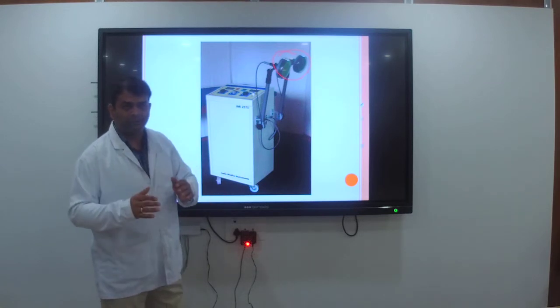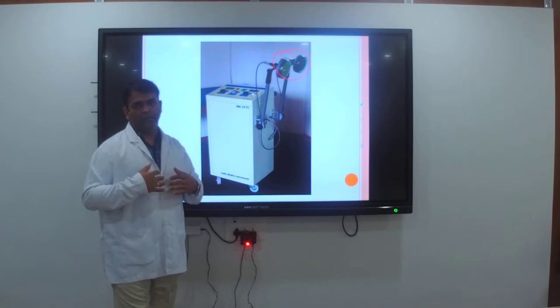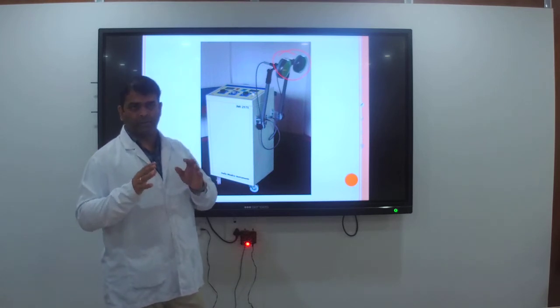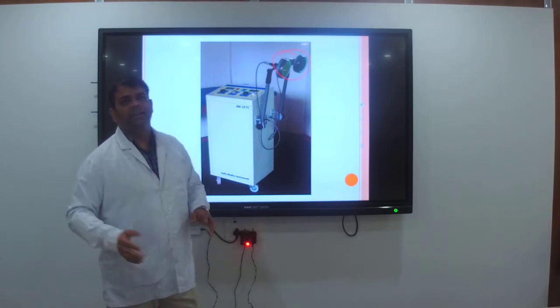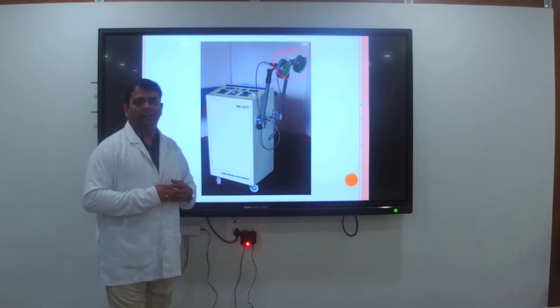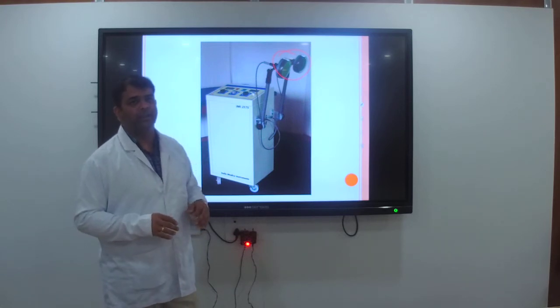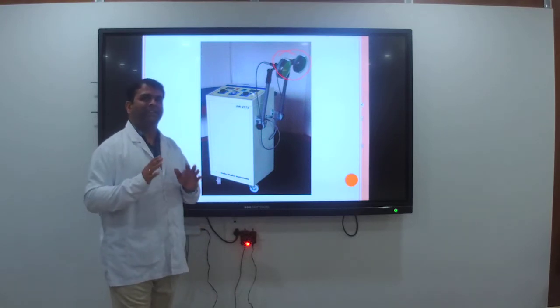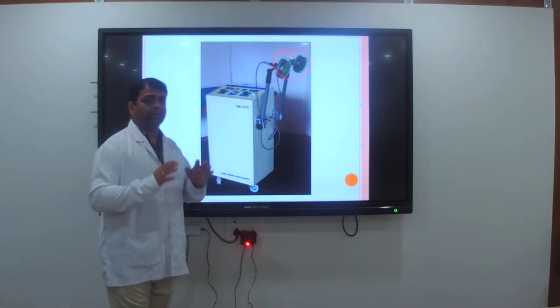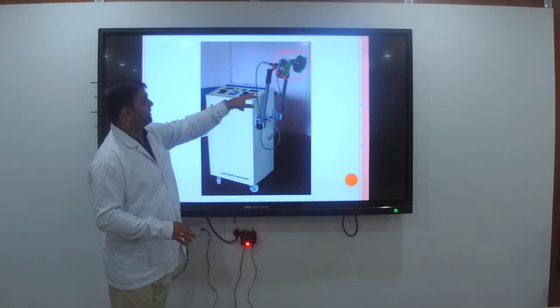The minimum is 10 minutes, 15 minutes according to me is a fairly proper time for the treatment. 20 is on a higher side. You should avoid giving it for 20 minutes; that's the maximum treatment time. So 10 to 15 minutes is an ideal time for treatment with SWD. Now this is the timer, you have to set the timer.